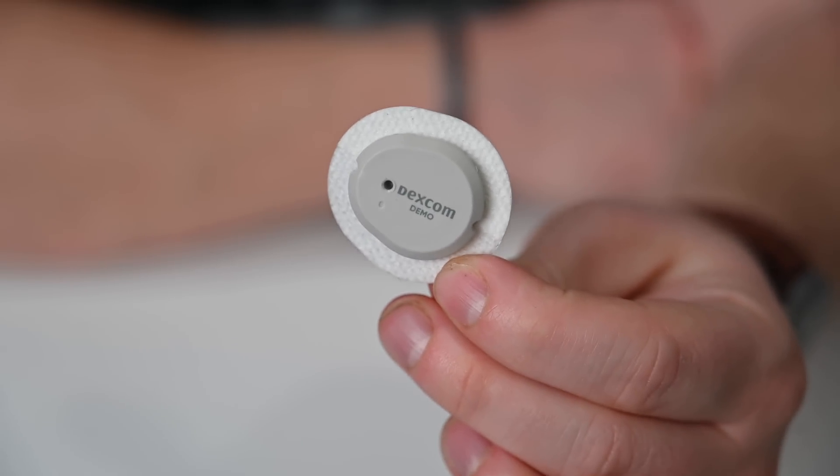Early 2023 is what we're looking at for full availability, but at least this is a first look at the hardware. I'm also excited to see when this works with the Tandem T-Slim pumps. Right now it's not supported, but Dexcom says they're working closely to get these integrated as soon as possible. I wouldn't be surprised to see a formal announcement from Tandem and Dexcom together in early 2023.